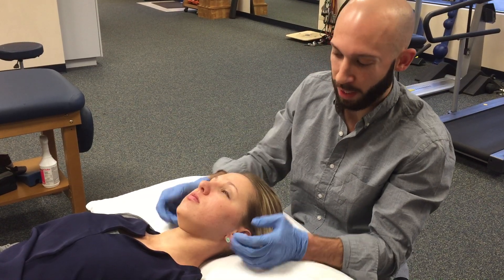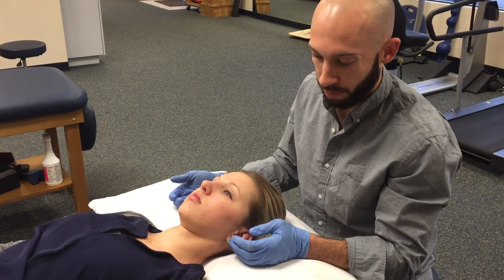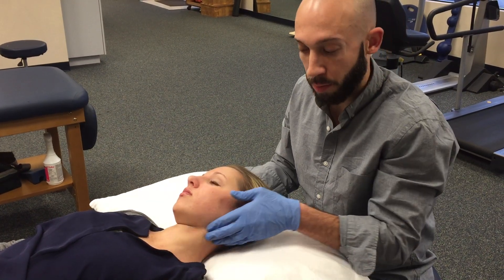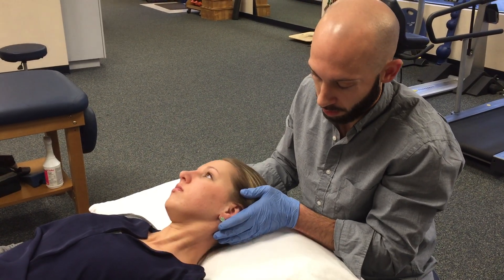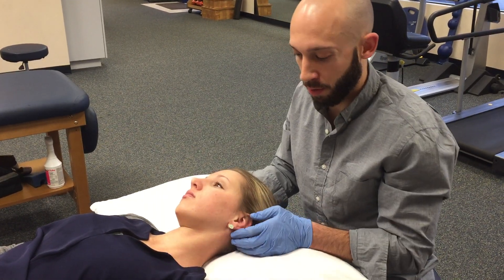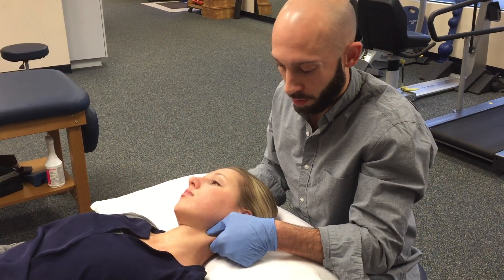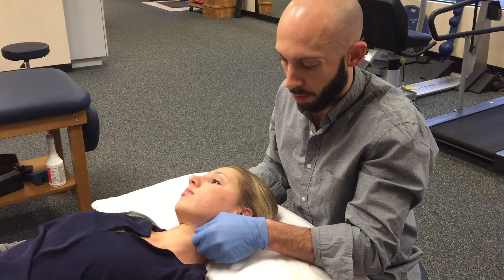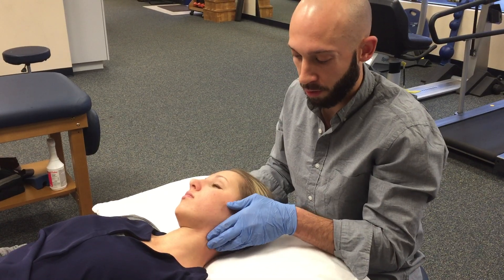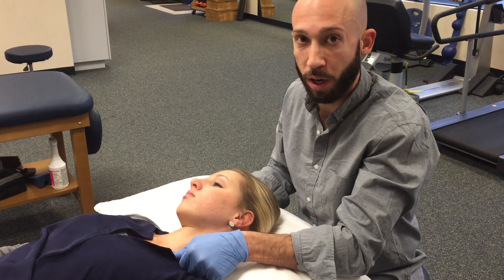First thing first, you can have your patient lay supine on the table and have them gently lift their head off the table. You should see that muscle kind of pop up right away. With her you can pretty clearly see both heads of the muscle. We can come down here and palpate where both muscles come together, then palpate down to the sternal attachment here on the manubrium. We can also follow down through the clavicular portion to identify where our muscle is.